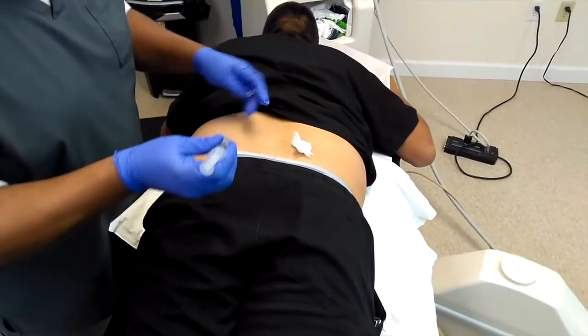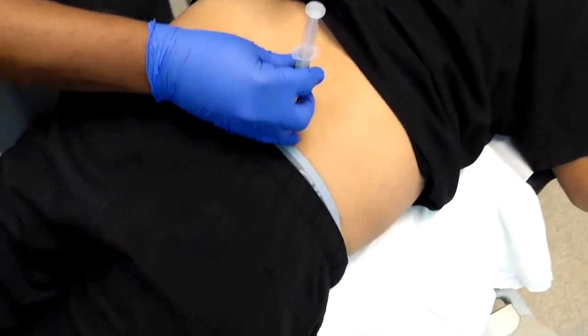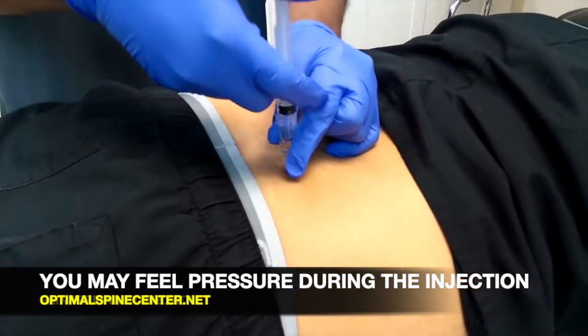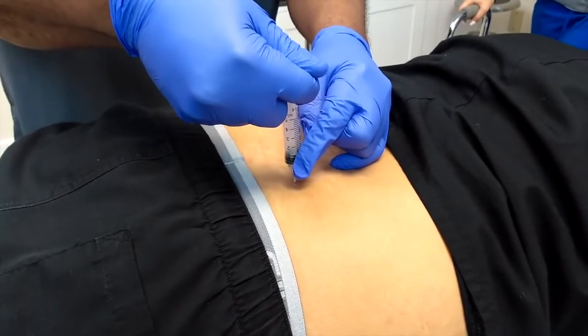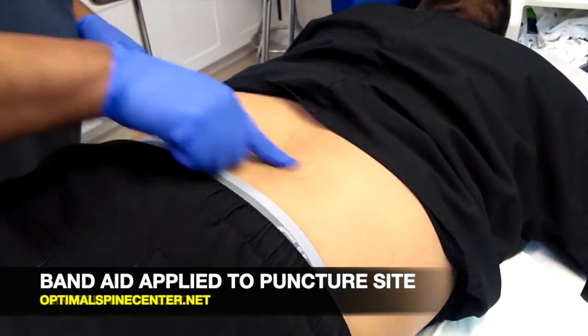After that, he will go ahead and apply the injection to the area that's injured and press down on the syringe to apply the medication. During this procedure, you may feel a little bit of pressure once the medication is going into your body. But once that's done, the doctor will go ahead and pull out the syringe and apply a band-aid to the puncture area so that there's no infection.